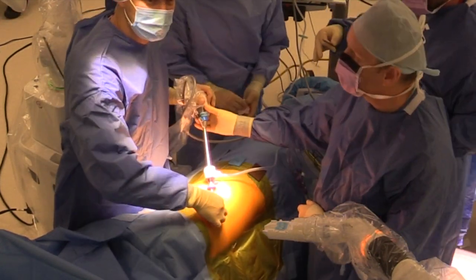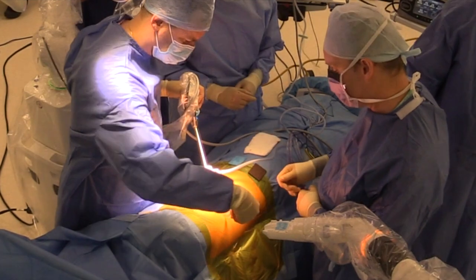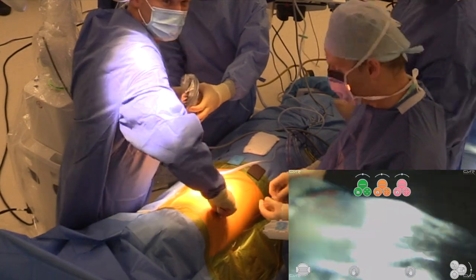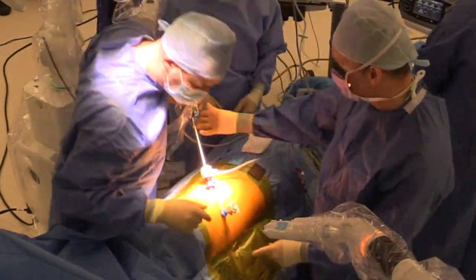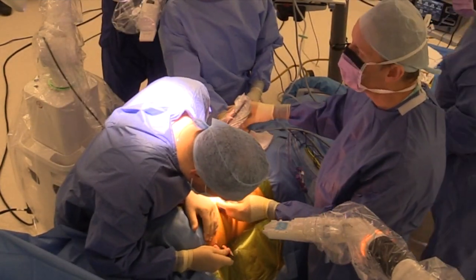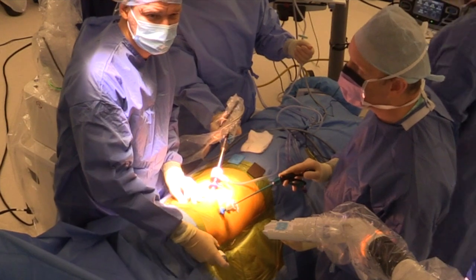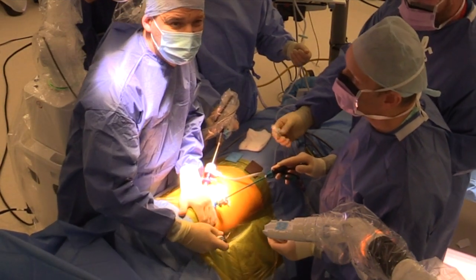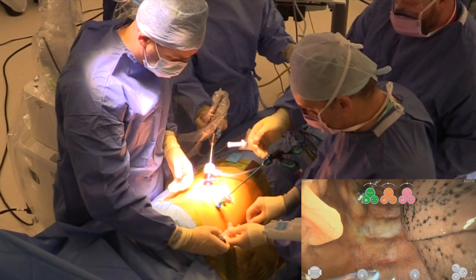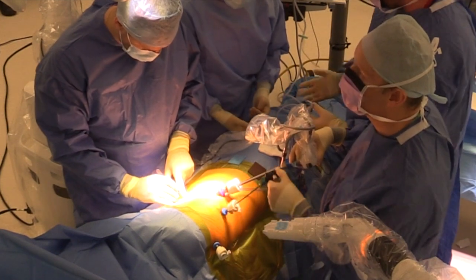After that initial port, we're going to do the rest from landmarks from inside. We're going to do two incisions — just five millimeter incisions — keeping them in the same intercostal space. This is going to be the left working arm, just a five millimeter Allied Medical CO2 port. Then this posterior port, which is relatively unique to this group and has really worked well, is the third arm — also a five millimeter Allied Medical port — which will serve as the retraction arm to assist the surgeon during the case.